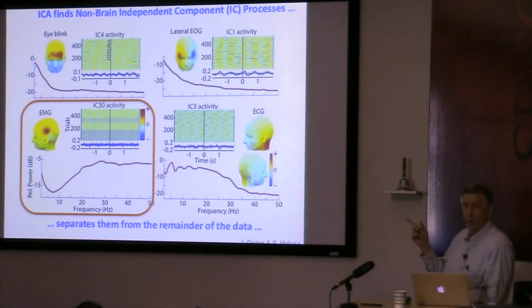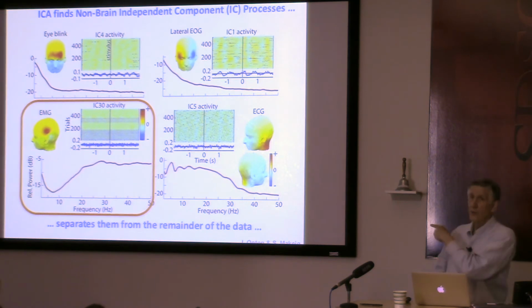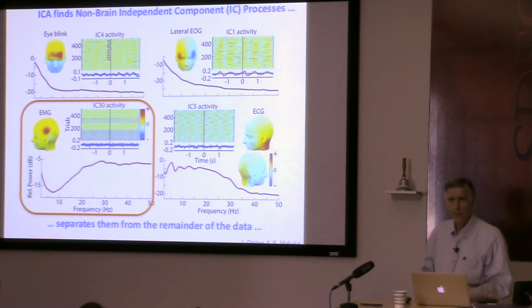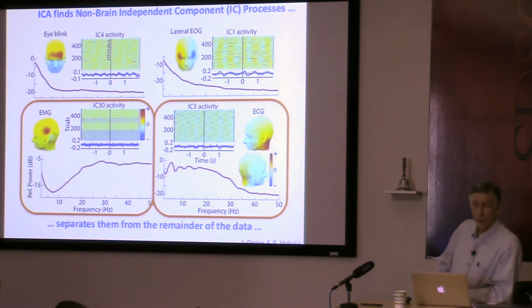Usually subjects are not aware of this, and that wouldn't be true of all the other muscles being recorded in this high density. So there's a lot of information about subject cognition in these muscle signals. I haven't had anyone say, oh, I'm going to study it, but here is ECG and its characteristic pattern of contamination.